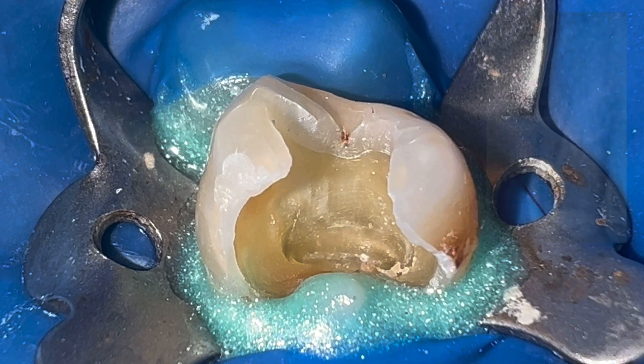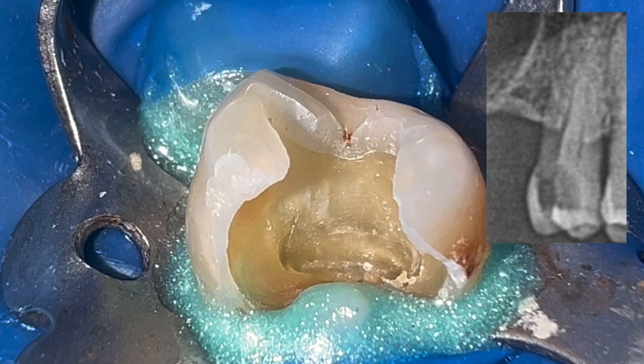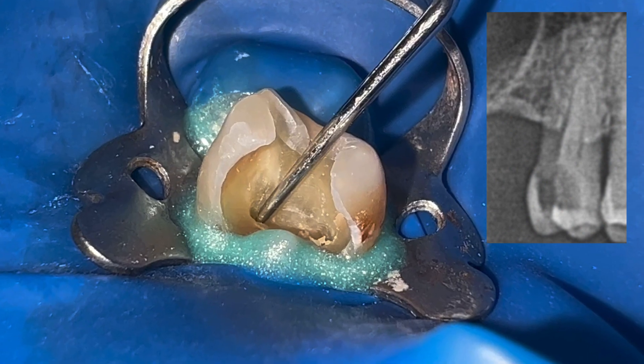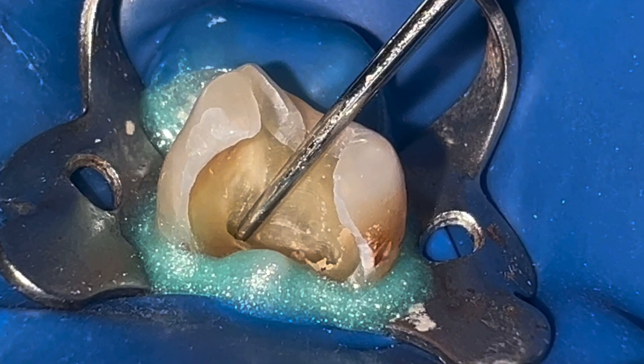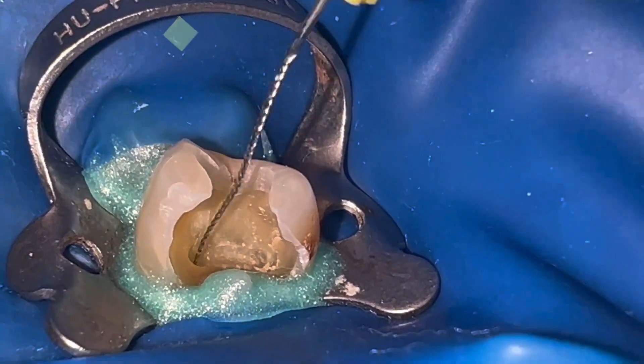Hello everyone. In today's case it is a classic upper first premolar with two independent root canals. The difficult part of this case was finding the canals, especially the palatal.